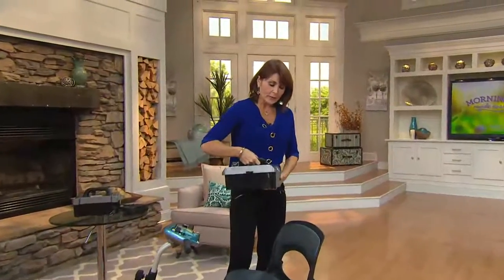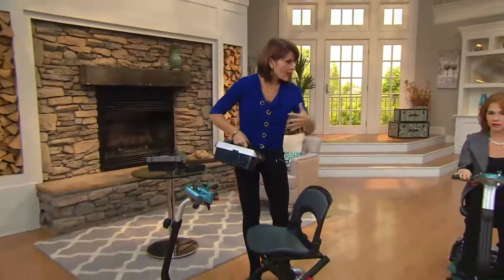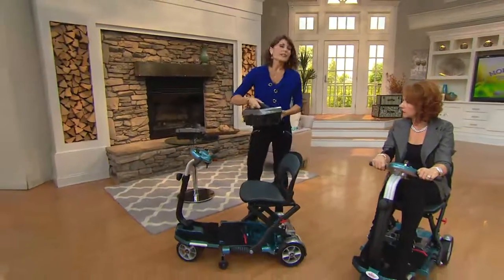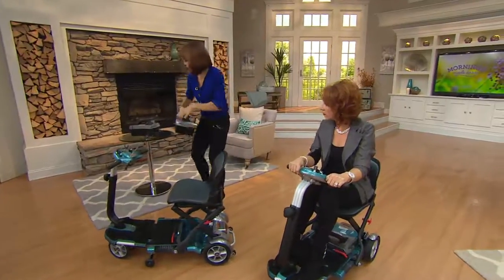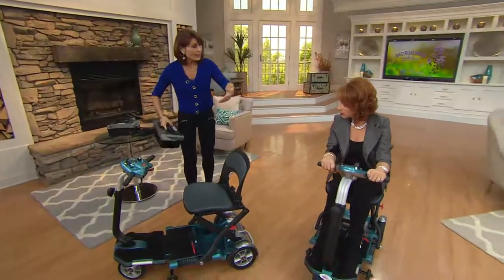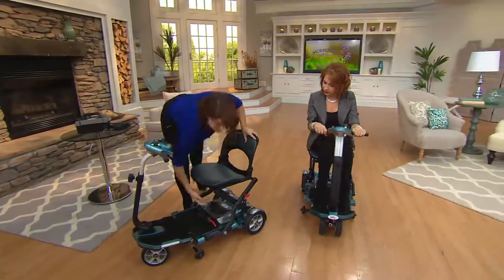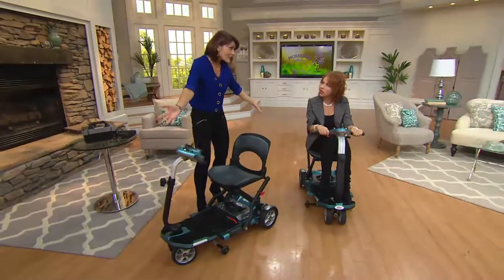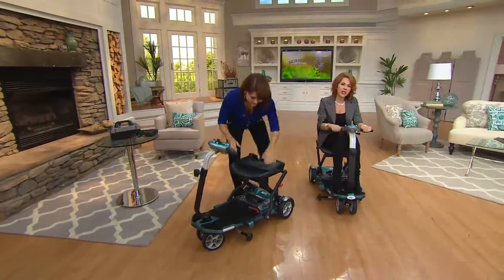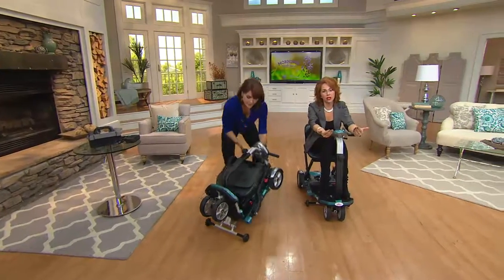If you tend to use this for travel and keep it in your car, you don't have to load the whole unit out — simply take the battery out, put it on your counter, and we give you all the components to charge it. You don't have to keep bringing it in and out. When you go to use it again, just install the battery and you're done. This could be a group gift that some children go in on together for their mother or father.